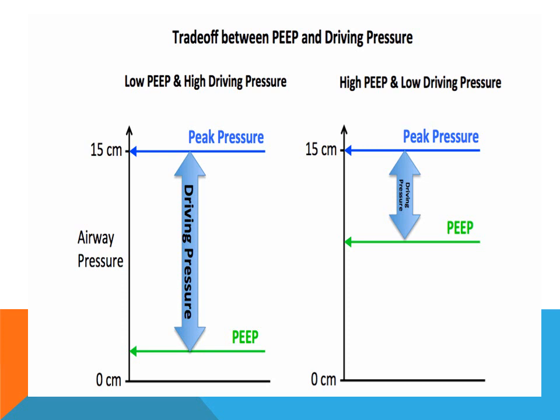Coming to the machine settings to optimize oxygenation, and here is the physiology of recruitment. In case you are giving a positive pressure to recruit the lung, we will be thinking mainly about passive ventilation, and we will be giving PEEP support. However, PEEP is only a part of the story. So mainly for the patient with respiratory failure, type 2 respiratory failure like COPD, we will be giving 5 PEEP support.